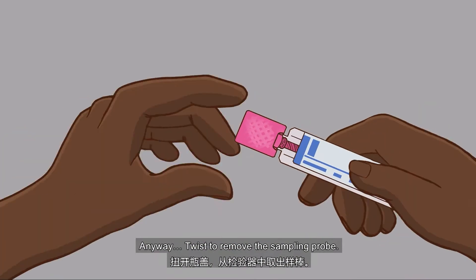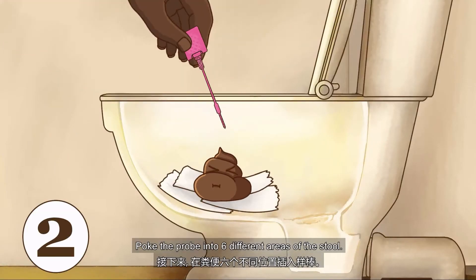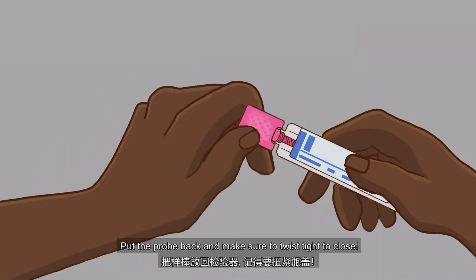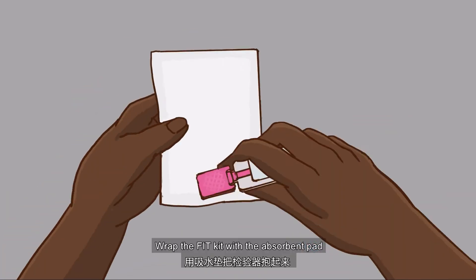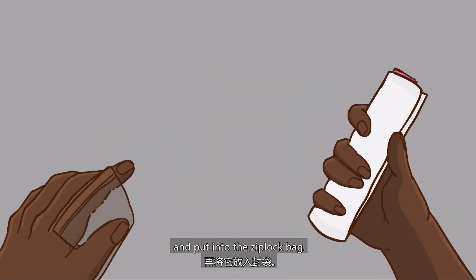Twist to remove the sampling probe. Hook the probe into 6 different areas of the stool. Put the probe back and make sure to twist tight to close. Then shake the kit several times.